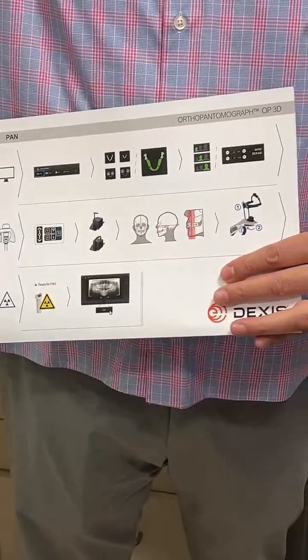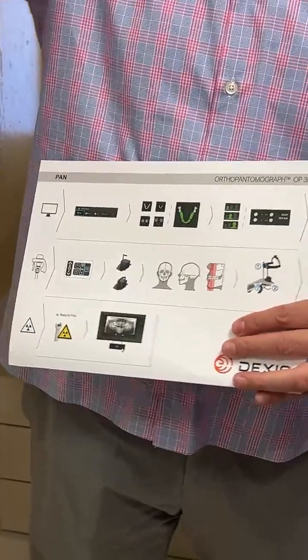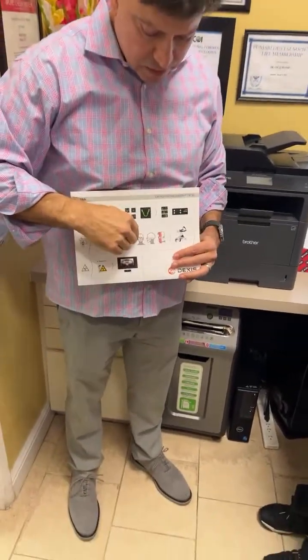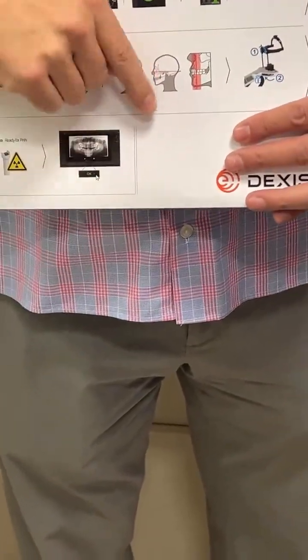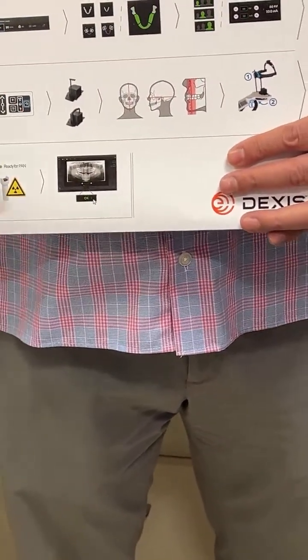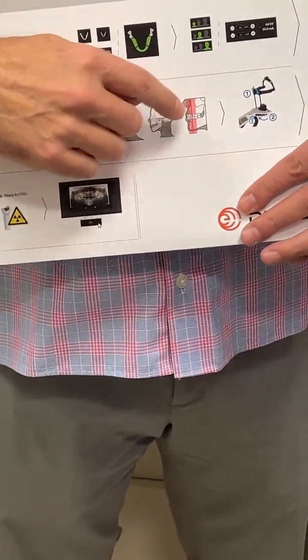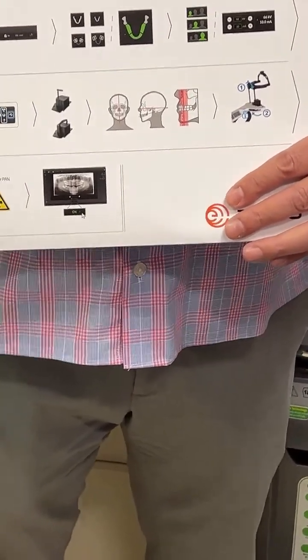And then the occlusal plane, if this is my condyle and my jaw, just a subtle 5-degree tilt downward. We don't want their occlusal plane here or like this. It's subtle. This picture here is sagittal Frankfurt. This is too straight up and down. I'd want this face to be coming forward 5 degrees. That's flat. Not the worst, but not the best. Don't need to worry about this. It does it automatically. And then your head support. Tongue to the roof of the mouth, lips around the bite stick, and fire.